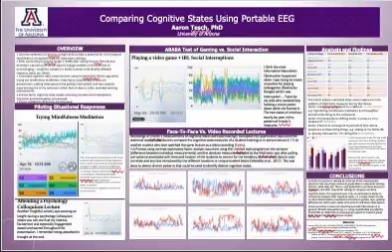And one of the things that I tried was mindfulness meditation. I thought this would be a good opportunity to try the Emotiv Insight and to see if the EEG could detect the cognitive state that I was going through as I tried mindfulness meditation.